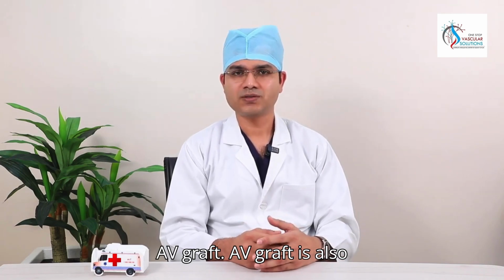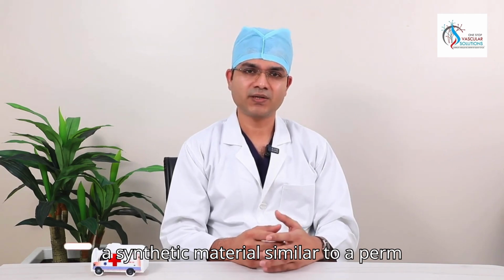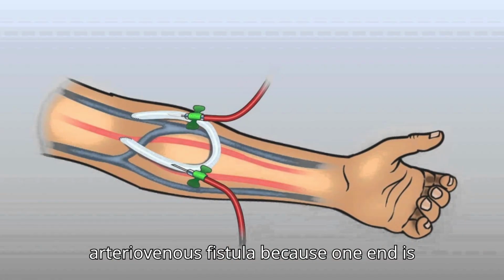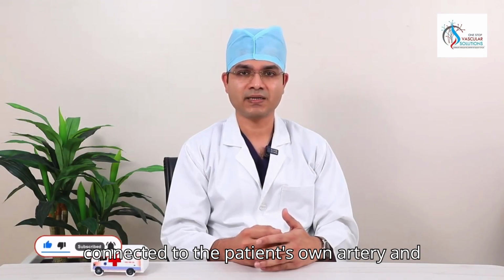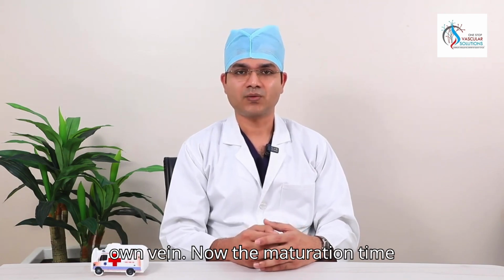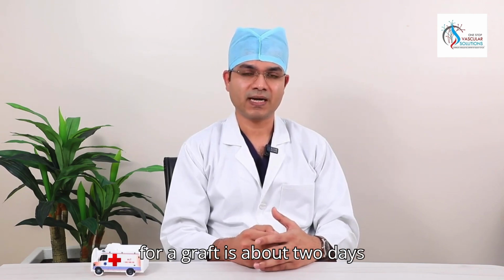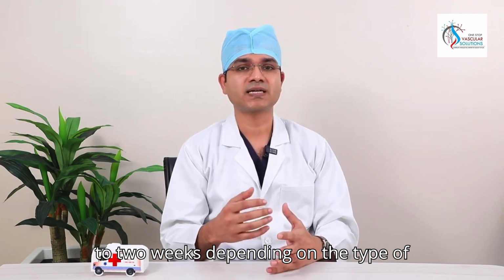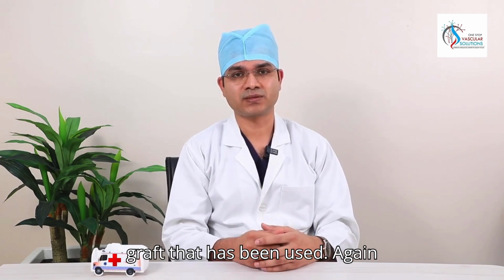Now coming to the second option, which is an AV graft. AV graft is also a synthetic material similar to a perm cath, but it functions like an arteriovenous fistula because one end is connected to the patient's own artery and the other end is connected to the patient's own vein. The maturation time for a graft is about 2 days to 2 weeks depending on the type of graft that has been used.